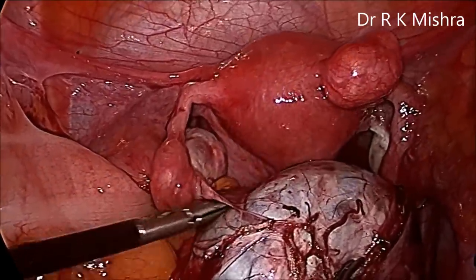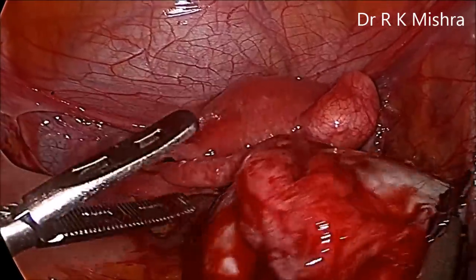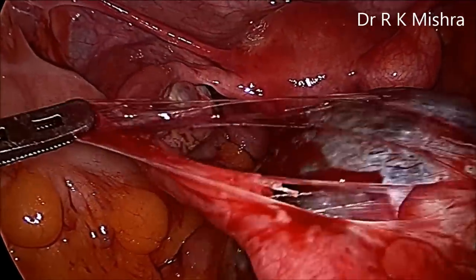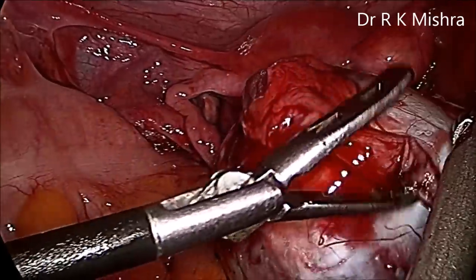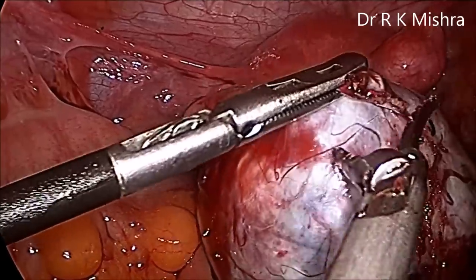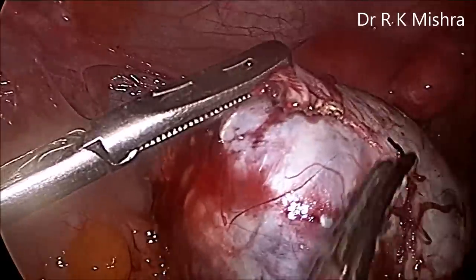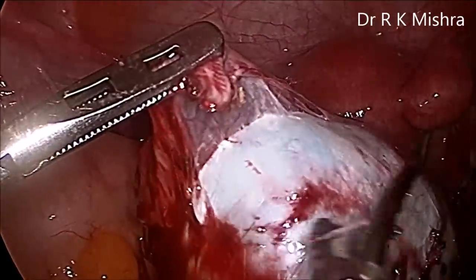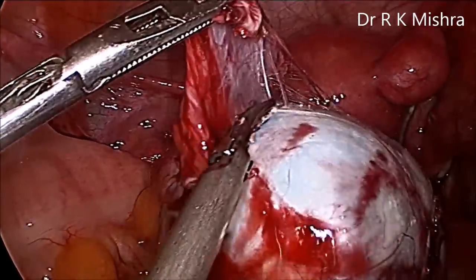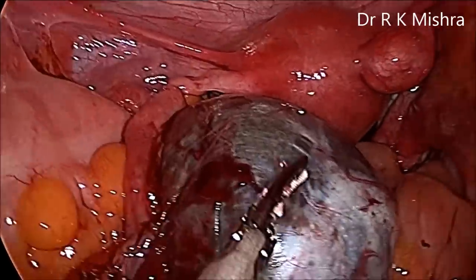So now this cyst is completely separated. Just a little attachment with the fimbria remains, which will also be carefully separated from the cyst. During laparoscopic ovarian cystectomy, the purpose of the harmonic is just to provide a plane of tissue dissection and not to directly damage the tube or the mesosalpinx.